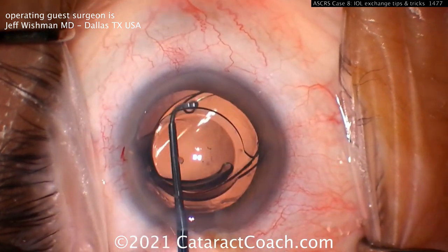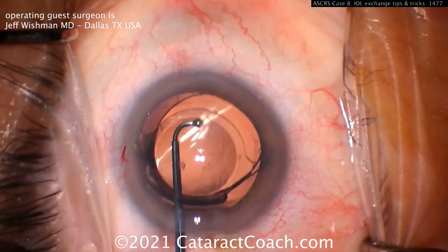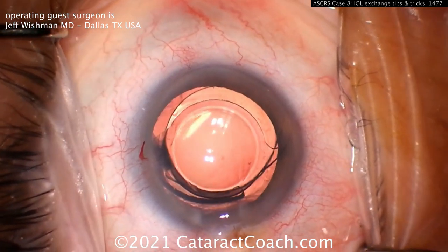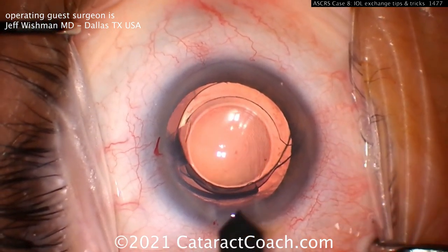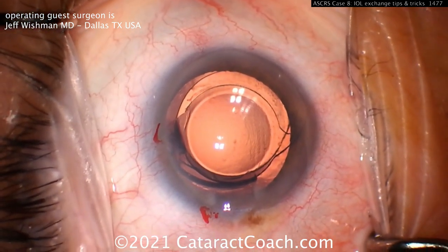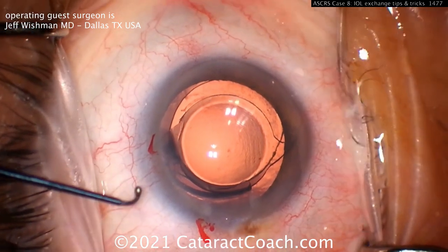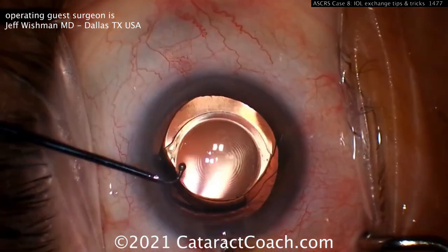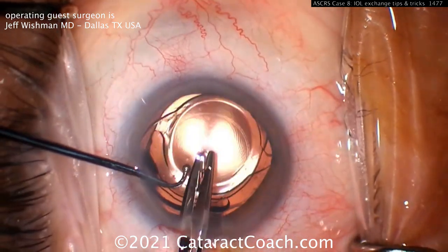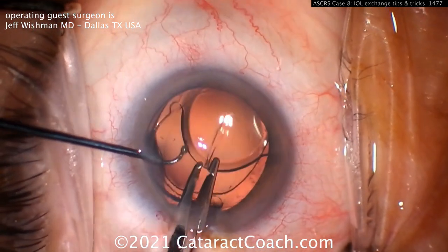With the new lens in the bag and the old lens up in the anterior chamber, add more viscoelastic for working room, then slightly enlarge the incision. You can cut the existing lens with a variety of instruments — this is a special IOL cutter, and scissors can be used as well. It sometimes helps to fixate the lens while cutting.